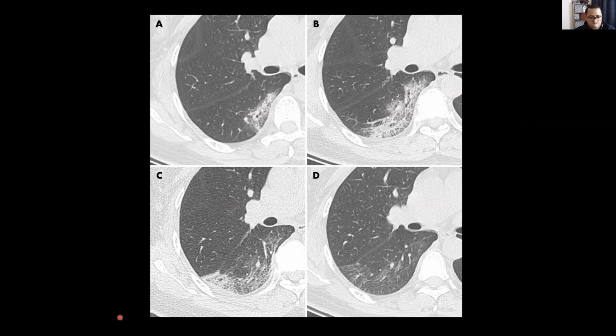So this is just showing you some progression, starting off with really ground glass opacities and some consolidated opacities. And a few days out, I believe this is 3 days and 7 days, you have more extensive ground glass, some crazy paving, some more consolidation. Okay, and then 11 days, as things were getting better, right? You have some more band-like ground glass, some new area of consolidation. And then by about 20 days, as you can see, there's just some faint ground glass and some band-like opacity. So probably some residual scarring at the time.